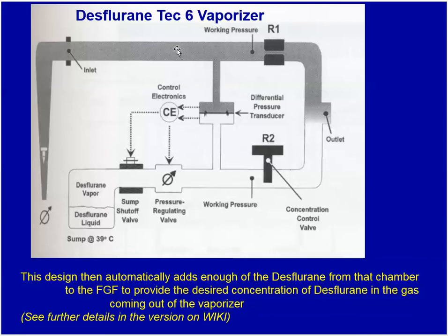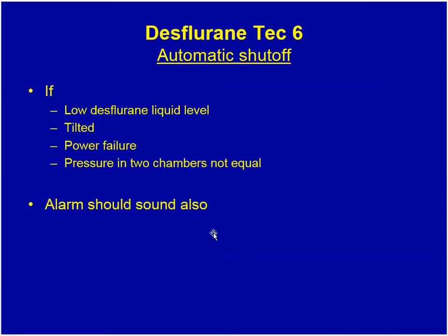Based on the known flow here, this machine automatically adds enough of this highly saturated Desflurane to the fresh gas flow to produce the desired concentration. More details about this are present in the wiki version of this podcast.